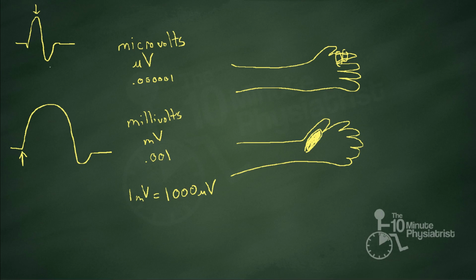So that's it for the real basics of SNAPs and motor nerve action potentials. Sensory much smaller, motor much bigger, a much different electrical generator generating that size, and the latency for the motor is from the onset, and the latency for the SNAP is peak.